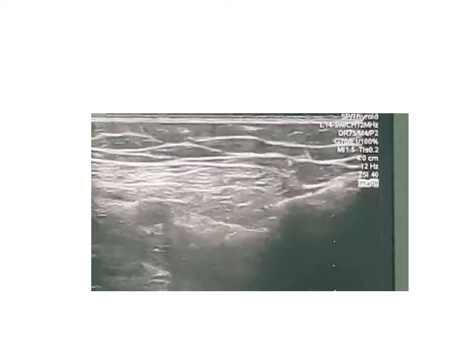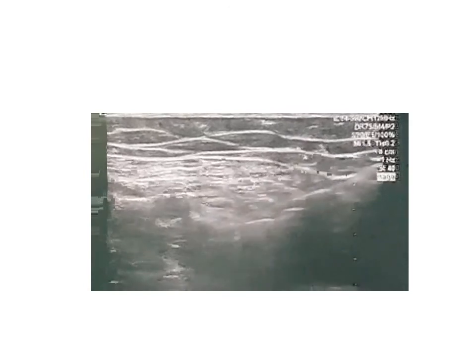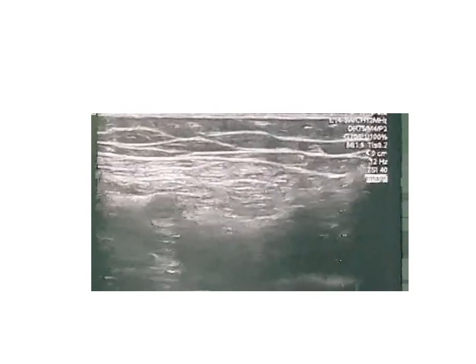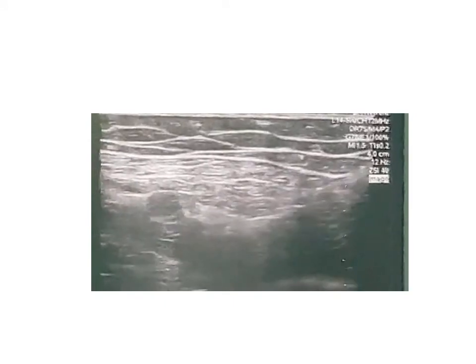Now the needle is coming from lateral to medial, approaching, doing the block. We will see it penetrating the muscle, moving, and now I feel resistance. This is the fibrous sheath that covers the adductor canal, targeting the hyperechoic mass lateral to the superficial femoral artery.